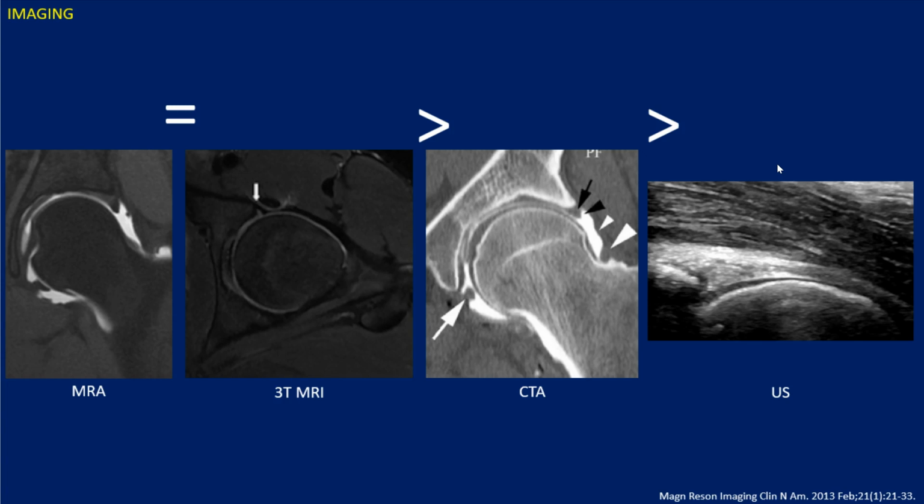This is in contrast to the glenoid labrum, whereby most of the tears at the superior biceps anchor are not readily accessible by ultrasound imaging due to the overlying bony anatomy. So when we discuss ultrasound imaging of labral tears, it is much easier to identify an acetabular versus a glenoid labral tear due to the location based on probability of where the tear will be and the subsequent accessibility due to the acoustic window from the ultrasound exam.